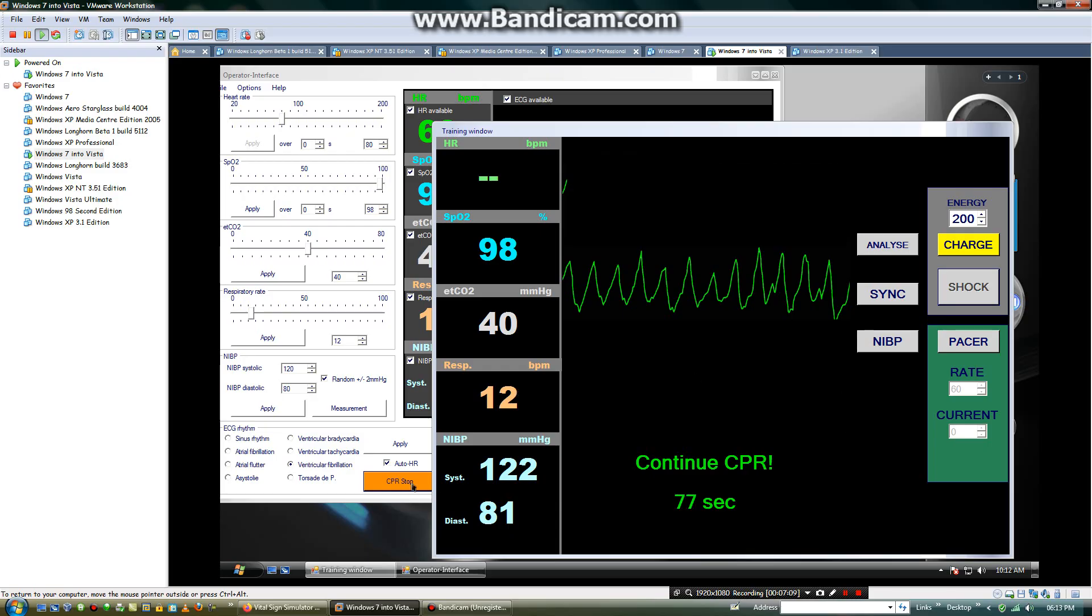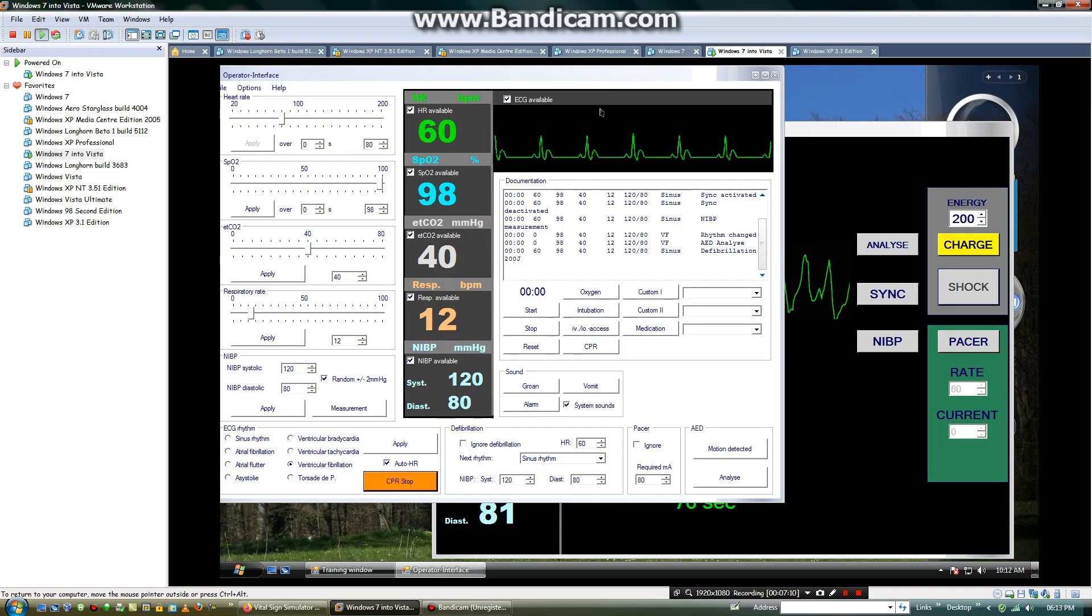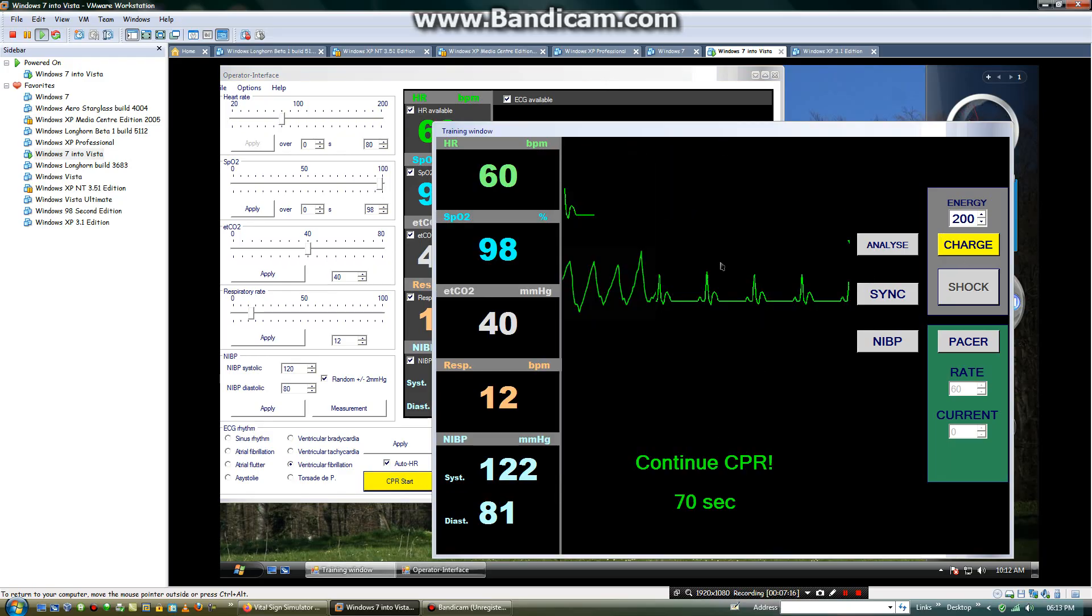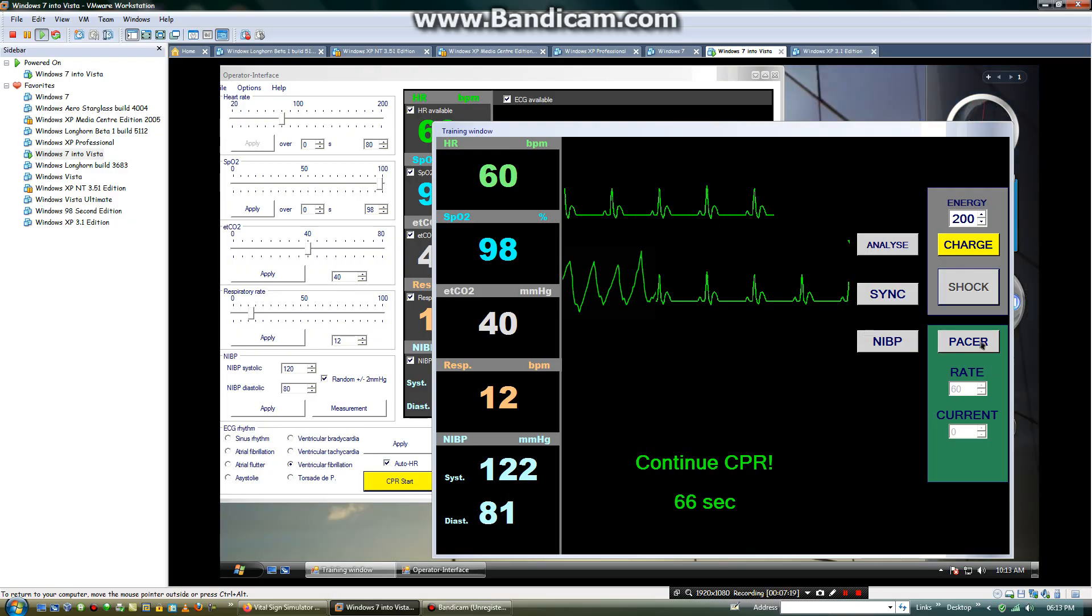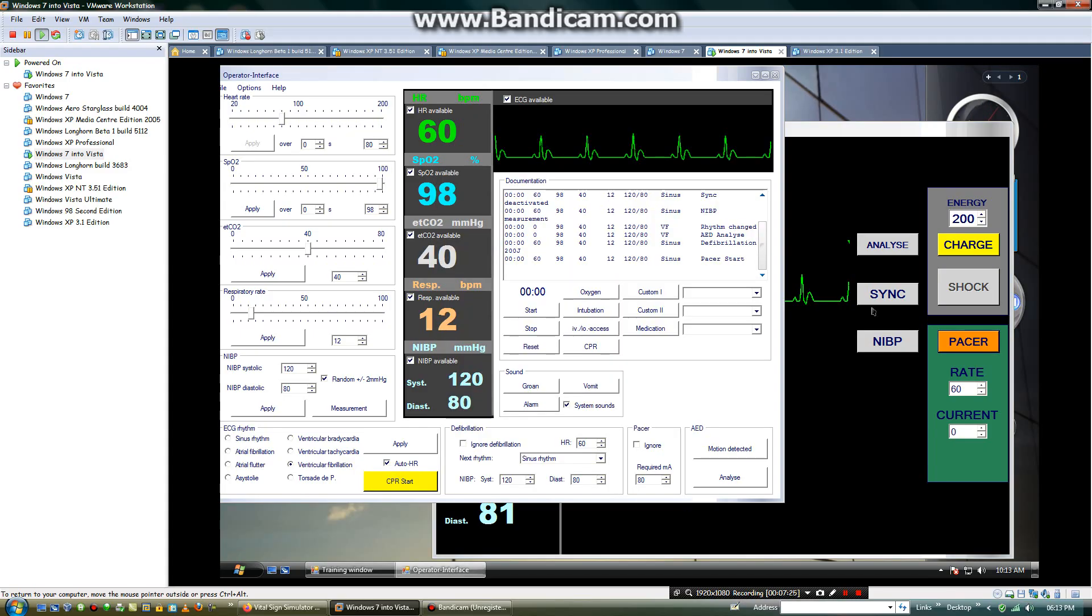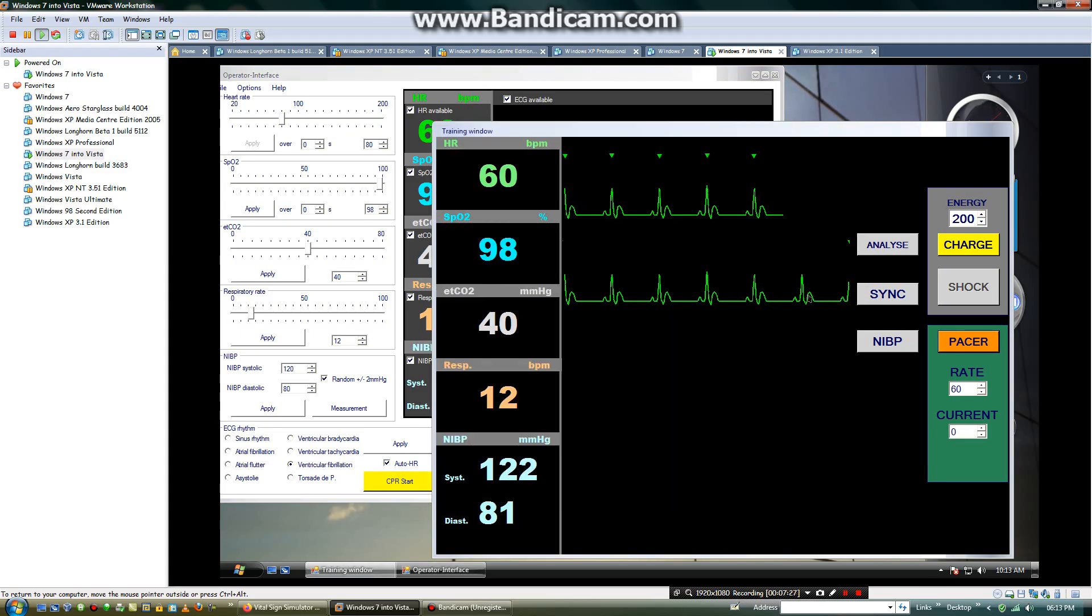And if you want to stop CPR, you will stop CPR. Then we will also have the pacer function available. Now in the pacer, you will be able to adjust the pacer. Click on the pacer.